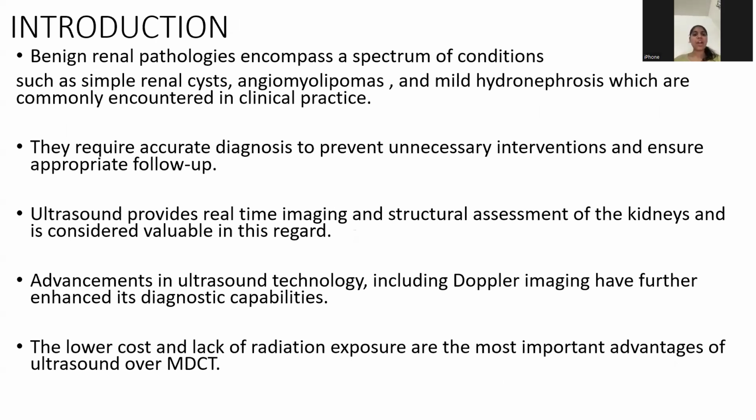Ultrasound provides real-time imaging and structural assessment of the kidneys and is considered valuable in this regard. Due to the improvement in technology and ultrasound settings, Doppler imaging has been a boon to radiologists because it is able to accurately diagnose renal vein thrombosis, renal artery stenosis, etc. Also, ultrasound is of lower cost, has no radiation exposure, and is very easily available, due to which it has the upper hand over MDCT in diagnosing benign renal pathologies.